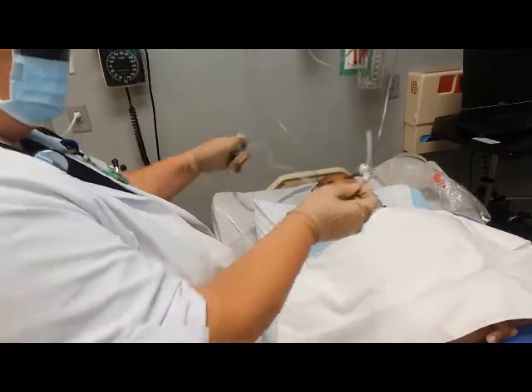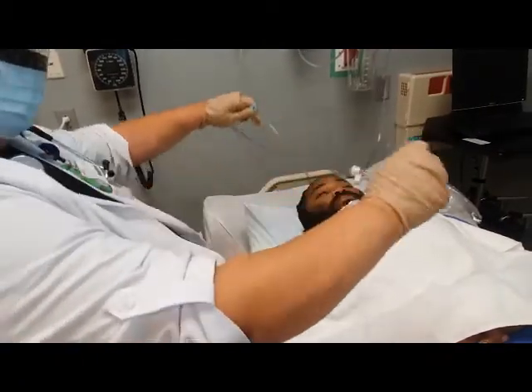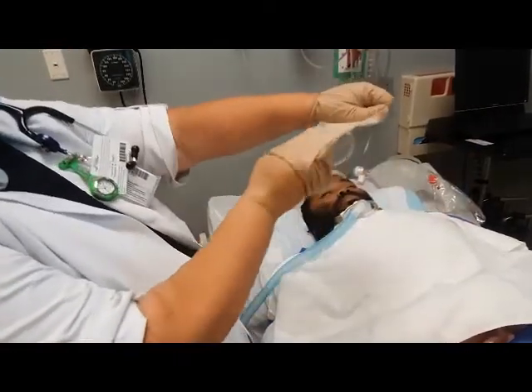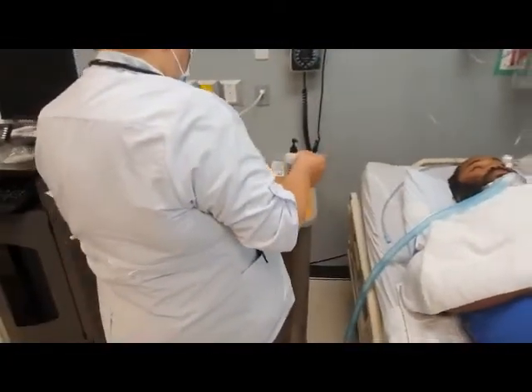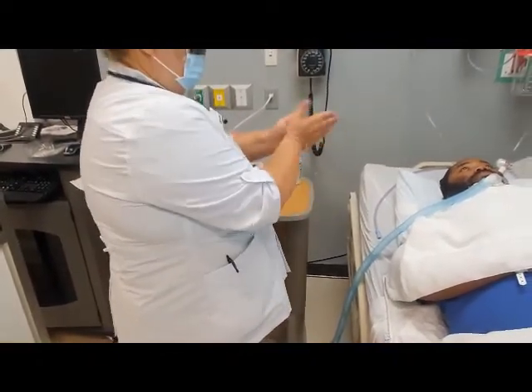Disconnect the suction catheter from the suction tubing. Grasp the cuff of the sterile glove. Pull the glove down over the used catheter. Discard catheter in both gloves. You will then clean your hands and apply new, non-sterile gloves. Okay, cleansing my hands.